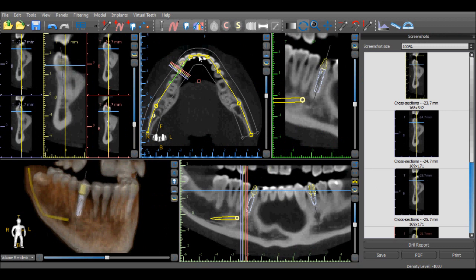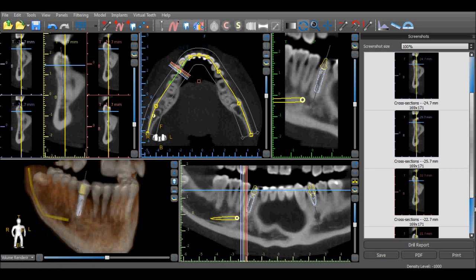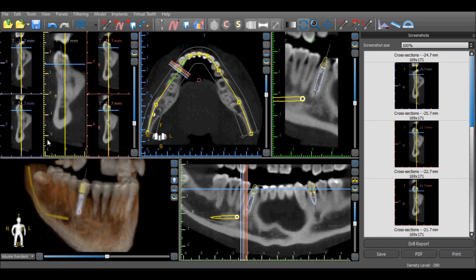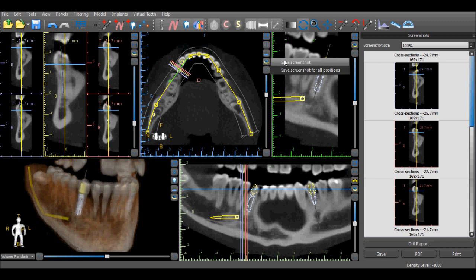After selecting an option, the screenshot panel opens and all the relevant images are added to the screenshot basket. Additional images can be added to the screenshot basket by once again selecting the camera to the right of a particular view and choosing to save the screenshot or to save the screenshot for all positions.